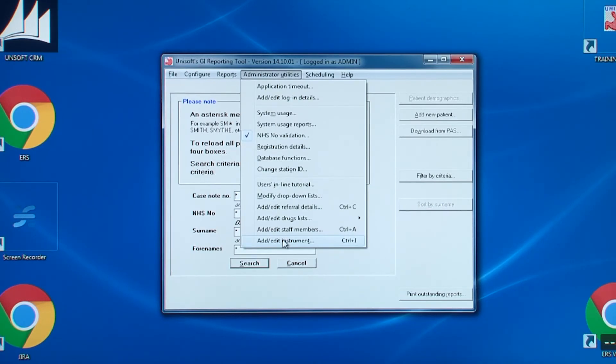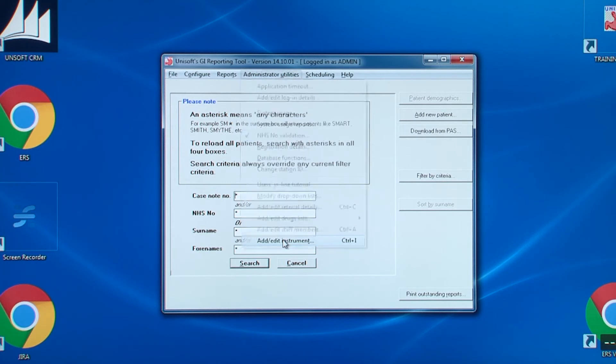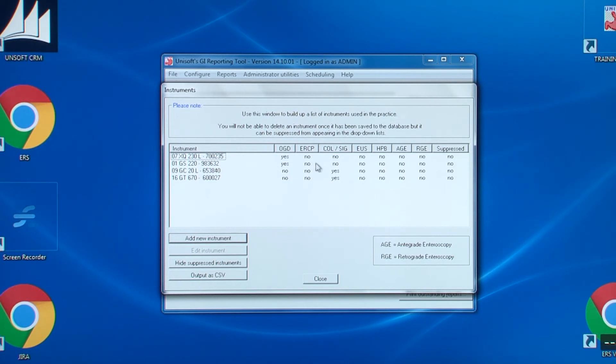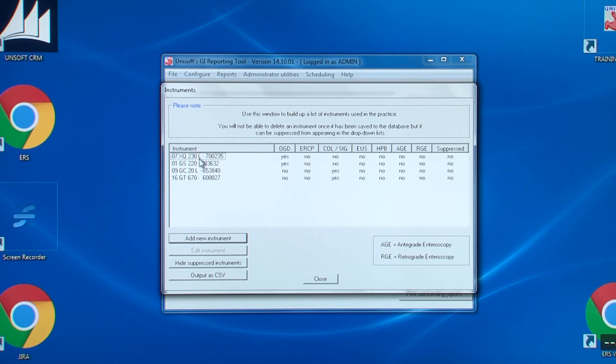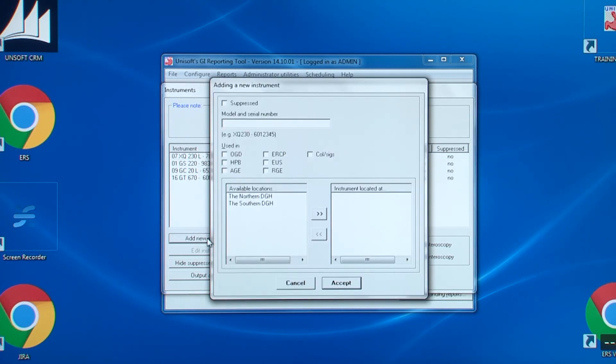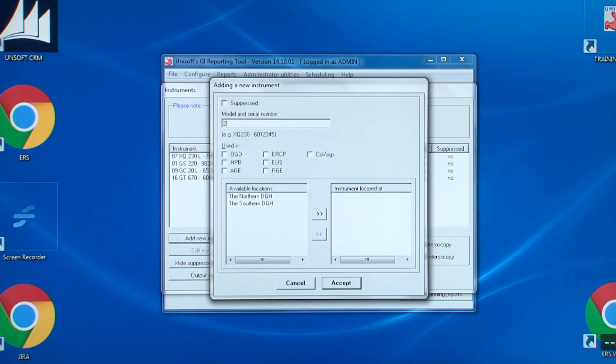Finally, the last item is adding and editing endoscopes. As with the other screens, you can click on the column headings to sort the list into alphabetical order based on the entries in that column. Here's an interesting point. Because the scopes are always displayed in strict alphabetical order in the procedure screens, it is best to begin the instrument with the number the instrument is commonly known by. Then follow that with the model number and finally with the serial number.